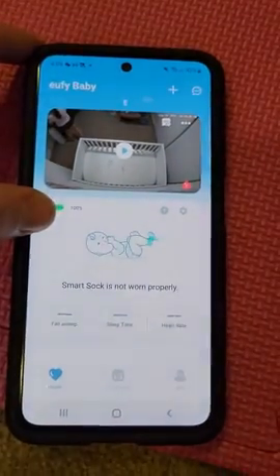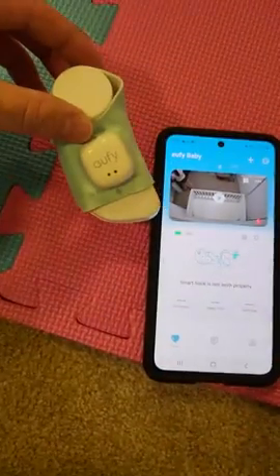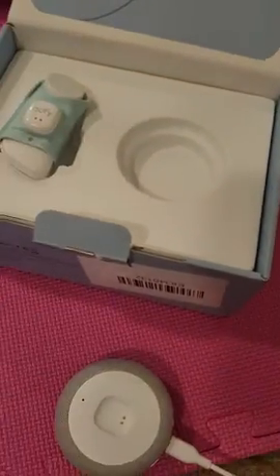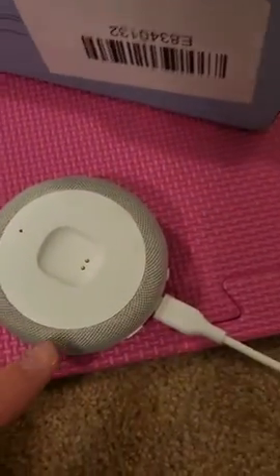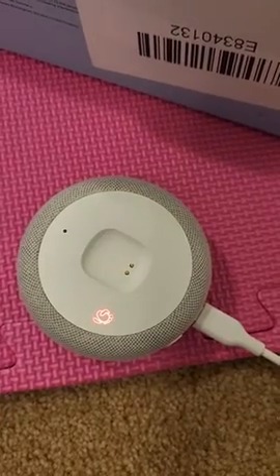If you scroll down you can see 'smart sock is not worn properly' because the smart sock is right here — it's on the little dummy foot that came with the packaging. It also came with the base. The base flashes when the socks are off to let you know, and it also flashes in the middle of the night if the baby is starting to stir.